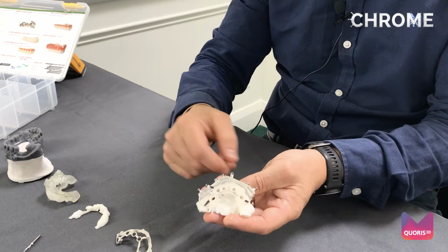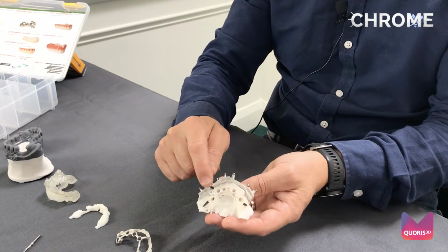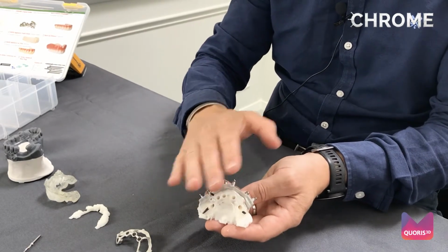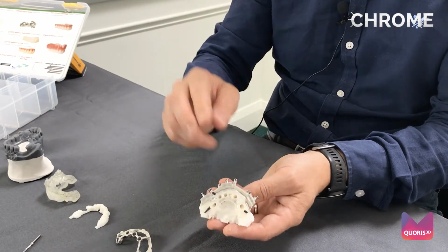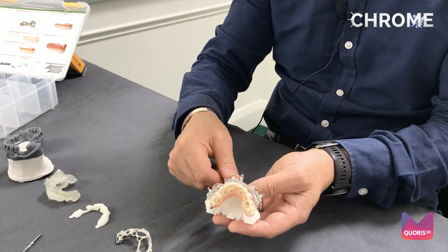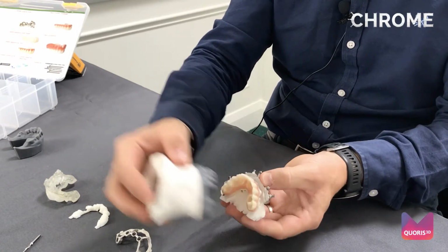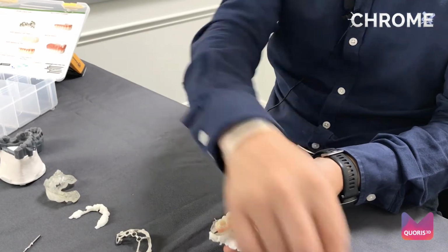The black lines indicate the position of the screw on the angled abutments or the angled MUAs, and these 2 little nipples help support the provisional. At this stage, you sometimes just need to adjust the angle of the abutments, but once you're happy that the abutments are there, you can then attach your temporary cylinders, and once the temporary cylinders are in, you then can slot on your provisional restoration. At this stage, you would check your bite and make sure that you're happy, and then you simply go and proceed to carrying out your pickup.